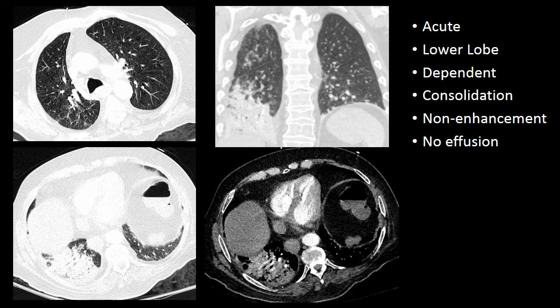When we look at the CT in this same patient, we can confirm it really is a lower lobe predominant process. There may be a little abnormality in the upper lobe, but we can see very dense airspace filling or consolidation in the lower lobes. This dependent, dense airspace consolidation with lower lobe predominance ends up being aspiration, which is more commonly seen in the lower lobes or in the dependent portions of the lungs.